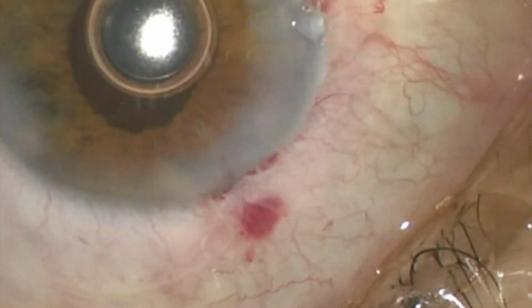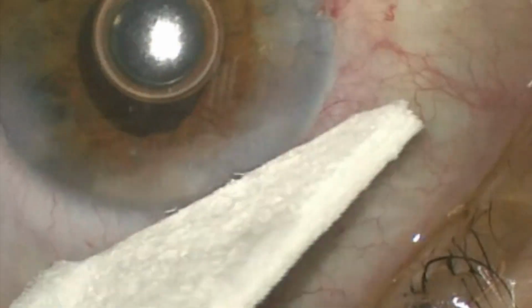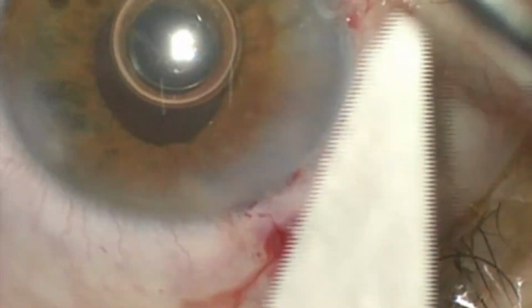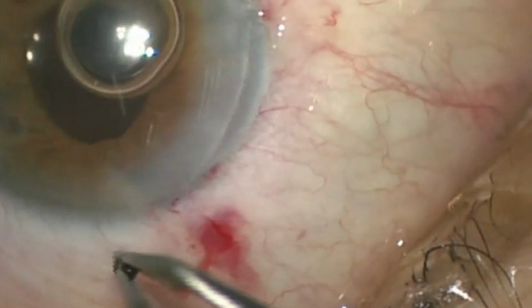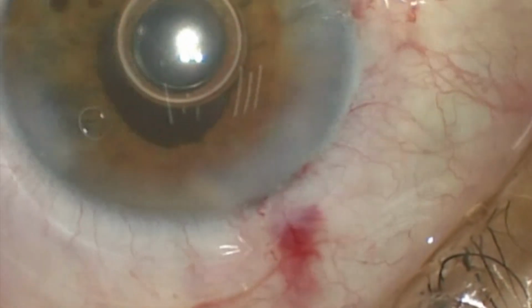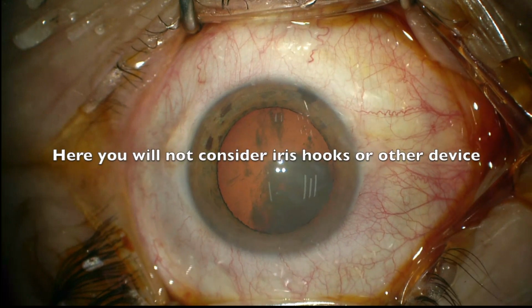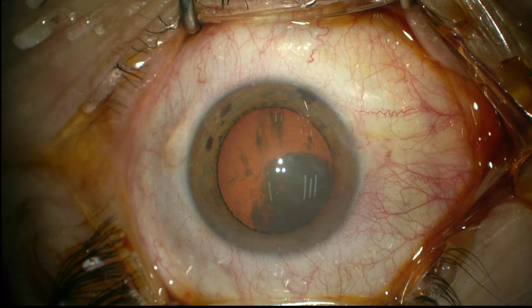So at this point you can remove the nylon suture from the main incision and it looks well sealed. It's a good outcome. Here are some tips. First, not all IFIS cases will show up initially, so be prepared for any situation, because usually you see poor mydriasis and you will probably use iris hooks or other special devices to open the iris from the beginning.